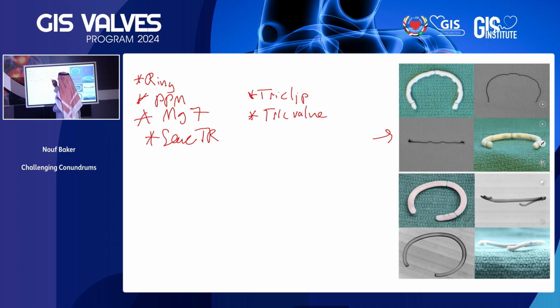The option of a TricValve, that's a possibility if the patient has anatomical suitability and they're not a candidate for any other approach. There is the option of a valve in ring. So a valve in ring in this particular patient with a flexible incomplete ring may not be the best option. Compare this to the second ring here at the bottom. That would be a Physio ring from Edwards. This is a rigid incomplete ring. That would take a SAPIEN valve. The problem with this approach is that in the area of where the ring is open, you do have 30% risk of having significant PVL, which you can manage with a plug if absolutely needed.